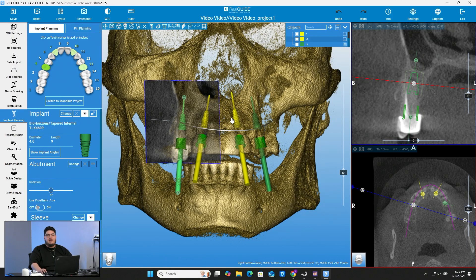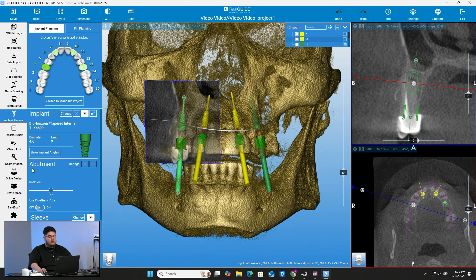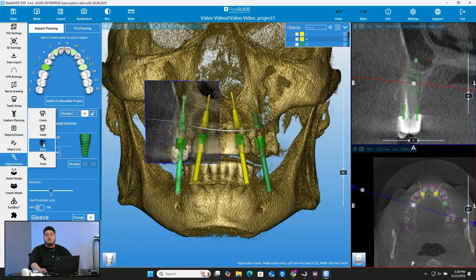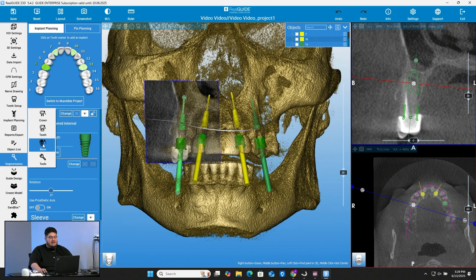What's really cool is that RealGuide is very fast and very automated in doing it — a lot of it isn't even manual, it's more just the click of a button. On the left side, you'll see all our tools, and one of the options is segmentation. Find segmentation and you'll see you can actually segment different things: a crown, a tooth, or even just the bone itself. What we want to do is segment the bone, so we're going to go ahead and left click on that.